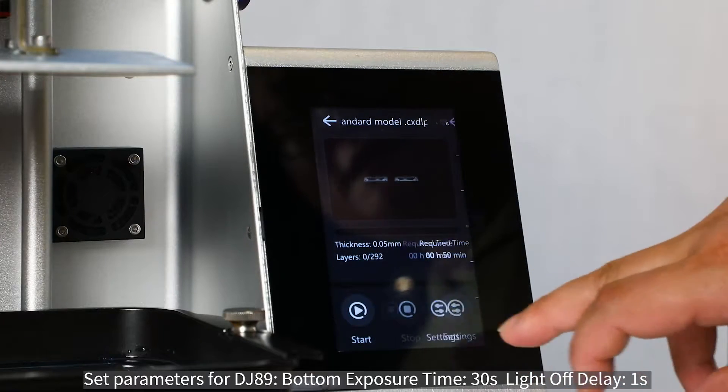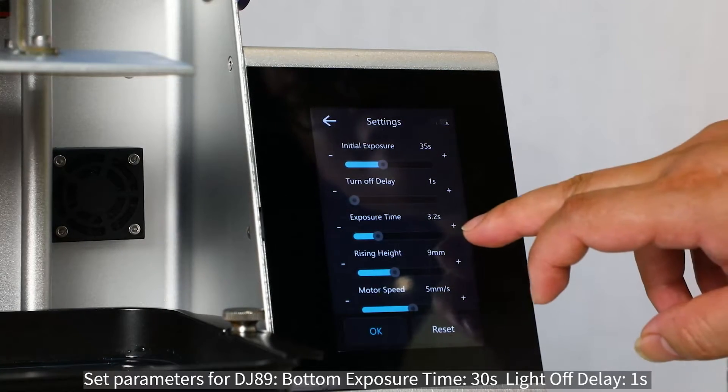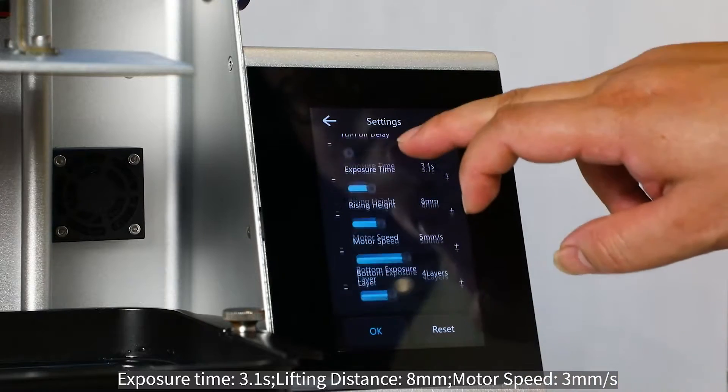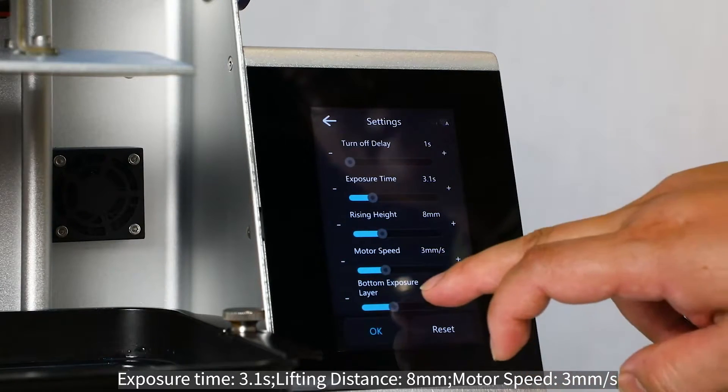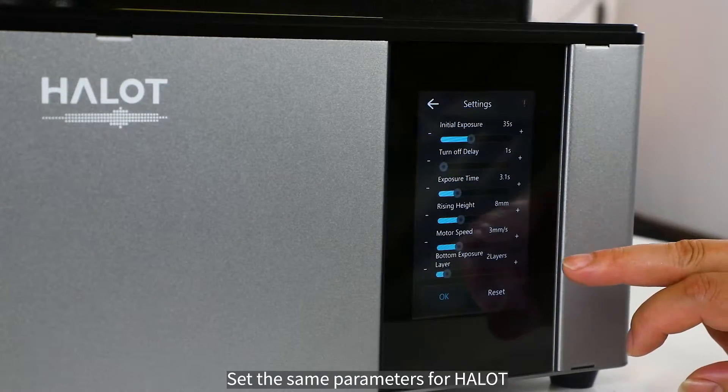Setting parameters for DJ-89: bottom exposure time 30 seconds, light-off delay 1 second, exposure time 3.1 seconds, lifting distance 8 millimeters, motor speed 3 millimeters per second, bottom exposure layers 2. The same parameters are then set for HALOT.